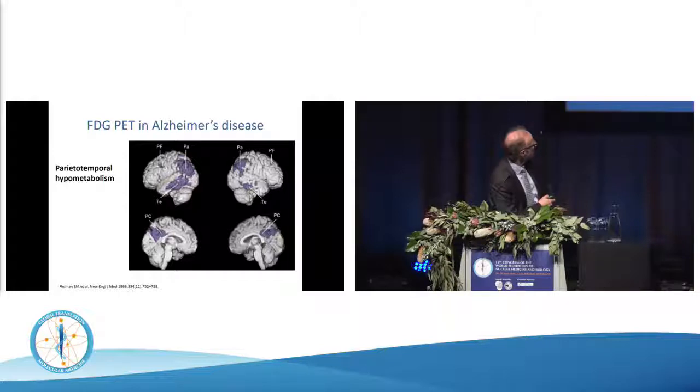This one doesn't show much frontal reduction, probably because this was created, I suspect, from younger Alzheimer's patients, but certainly in older Alzheimer's patients, you also see a lot of frontal reduction.